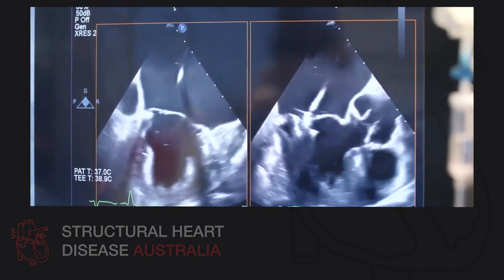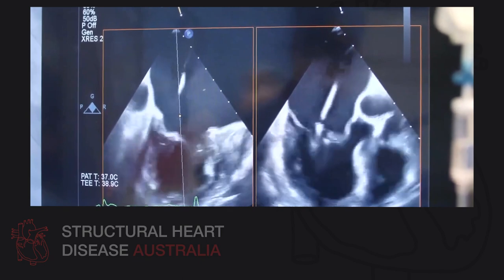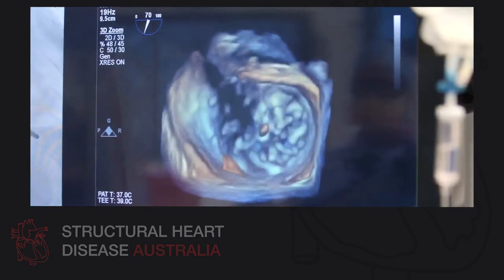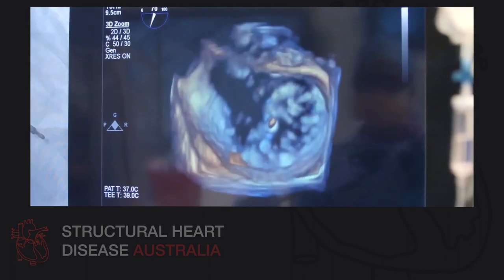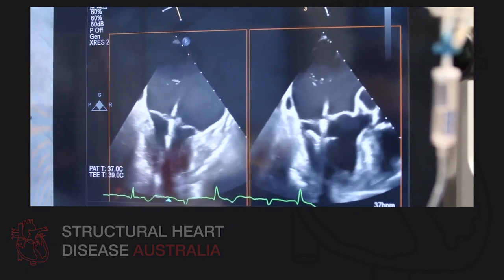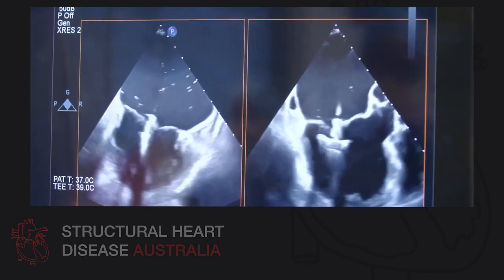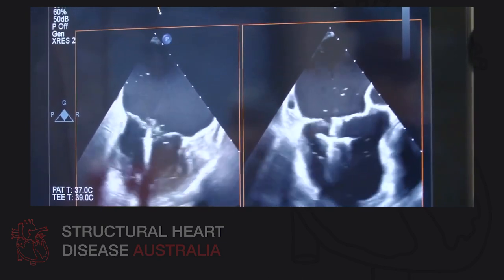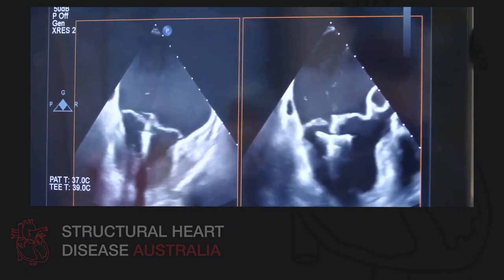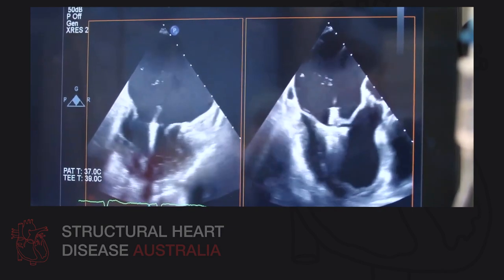So I'm going to put some plus knob on. So we're just correcting the trajectory of the mitral clip. I think rotation is pretty good. We're quite central there, and our orientation, our sort of trajectory, is a bit better. Now the anterior is back on. I think the posterior is almost to the apex of the device.